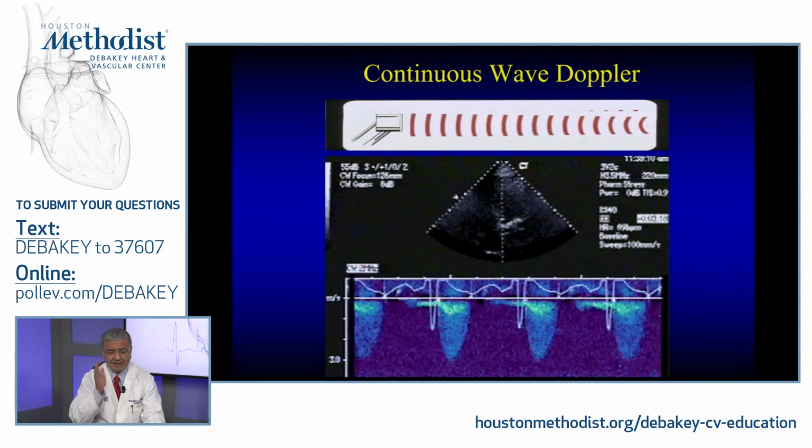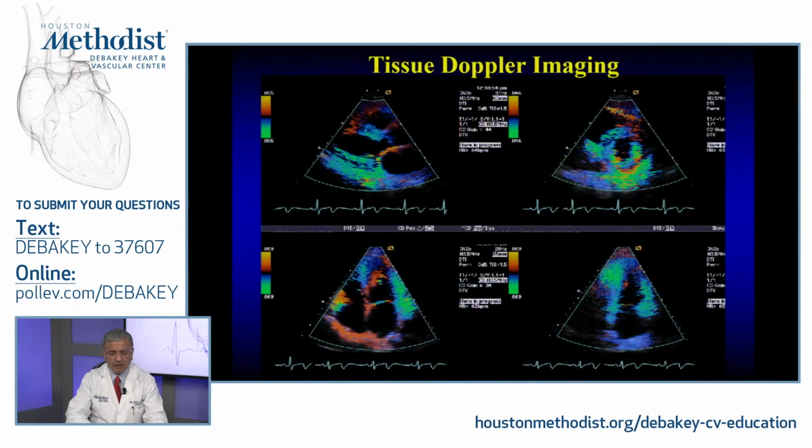The difference is I can interrogate all these velocities along that line, and the highest one will be demarcated. So this is an aortic stenosis jet. You could see that very nicely here. These are the velocities most likely in the LV outflow or in the ventricle itself. So remember, CW is along any of this here. At times you may have an obstruction in the middle of the cavity, and this is the highest velocity that you can have. So you have to interpret that accordingly.